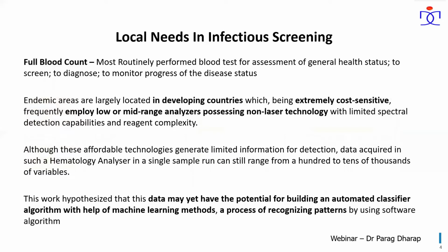Full blood count is most routinely performed blood test for assessment of health status of a person. Endemic areas are largely located in developing countries, which, being extremely cost sensitive, frequently employ low or mid-range analyzers possessing non-laser technology with limited spectral detection capabilities and reagent complexity.